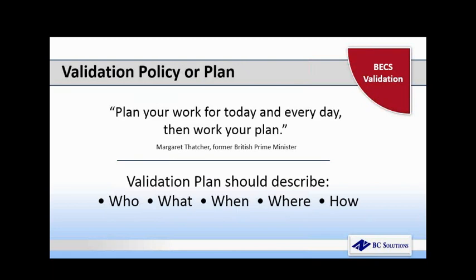Next slide, please. The first element we're going to talk about is your validation policy or plan. You may also know this as a master validation plan. You may call it a complete change control process or your validation process. But whatever it is, it's going to describe your plan of action for validation, what actions you need to do to obtain and maintain a safe and compliant blood system.